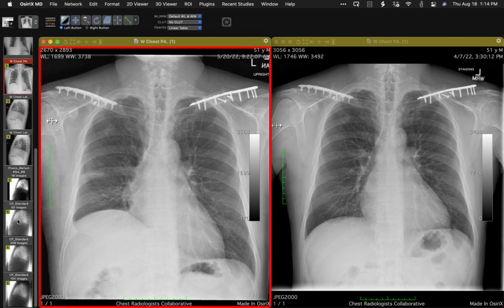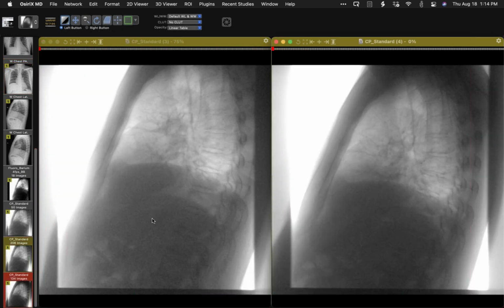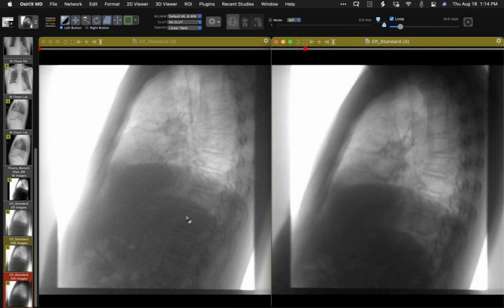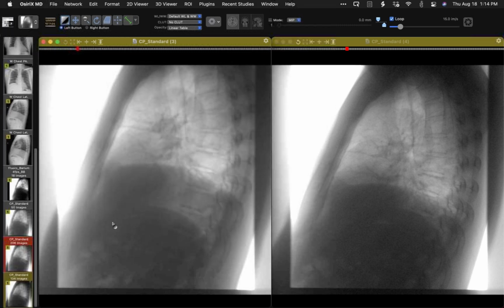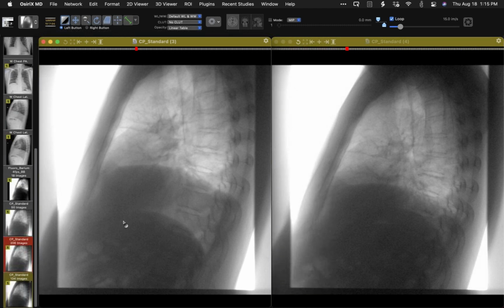And now I'll show you some images from the fluoro. So let me show you these two. On the left, and I'll play this, will be a single deep inspiration. Sorry, not that one. This one first. So I usually let the patient breathe in, and then I'll stop this for a moment. Just for those of you that don't do these very often, I give the patient the instruction to take a deep breath when the diaphragms have moved up and the patient is ready to take in the next breath.